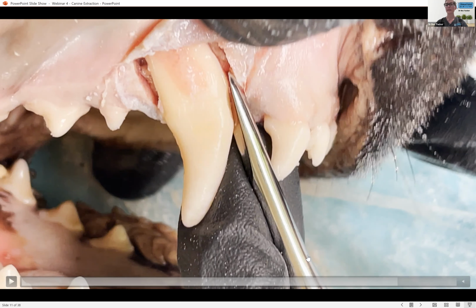The thing that I guess we notice when we're teaching the students out at uni is they'll do that and then they'll pull out as well. So insert, rotate, hold, go back to a neutral position, and then push in a little bit further, and then do that again, and do that a couple of times before you switch positions, and that will get you deeper down or into the alveolus as well.